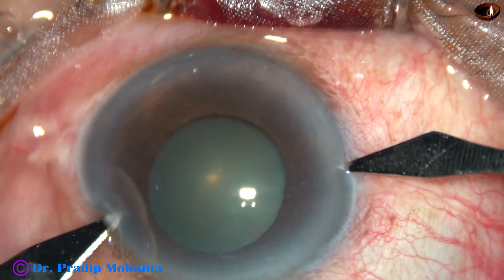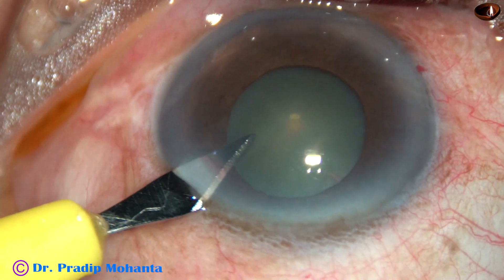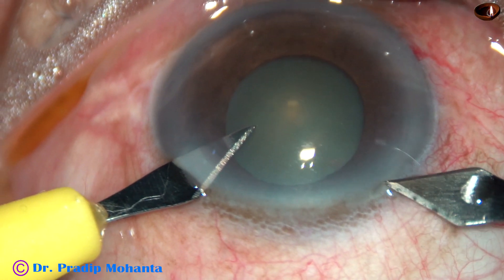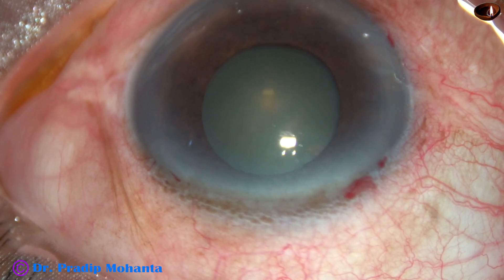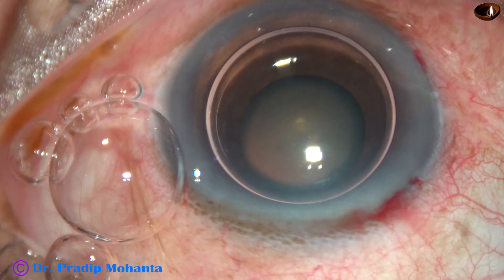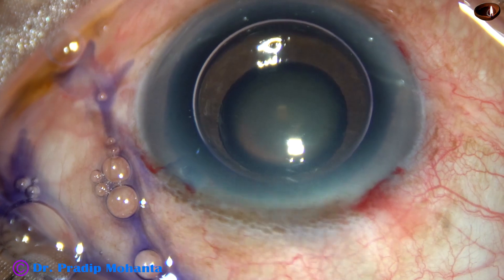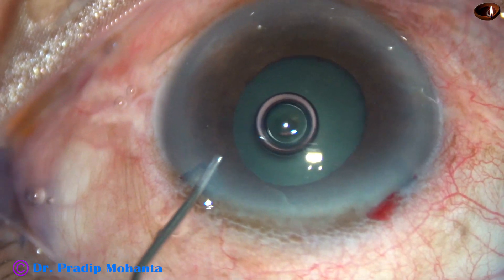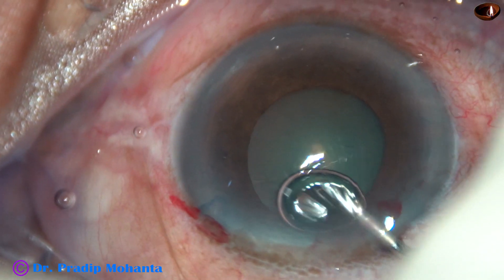Two paracentesis openings are being made almost simultaneously, and then the main incision is made at the mid-limbus with a 2.8 millimeter keratome. An air bubble is injected into the anterior chamber, and then trypan blue 0.06% dye is applied over the anterior capsule underneath this air bubble. Some adrenaline has been injected and now viscoelastic is being injected.